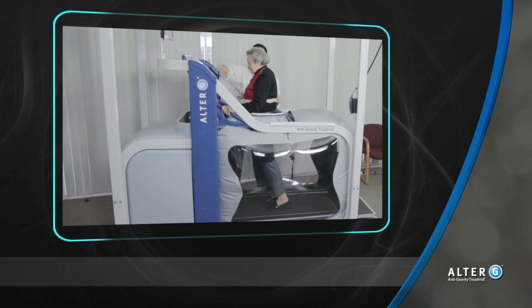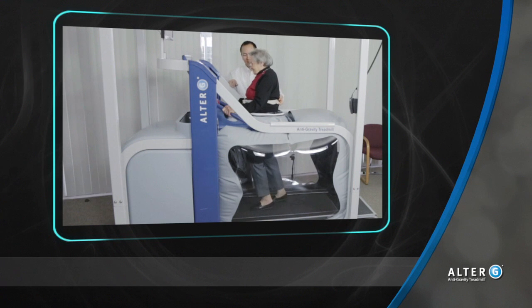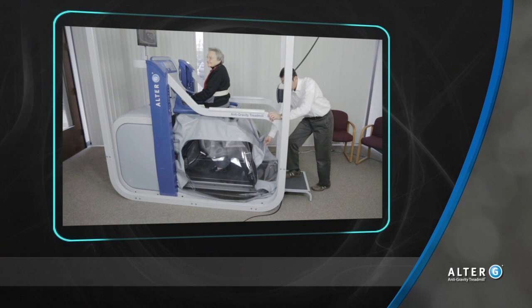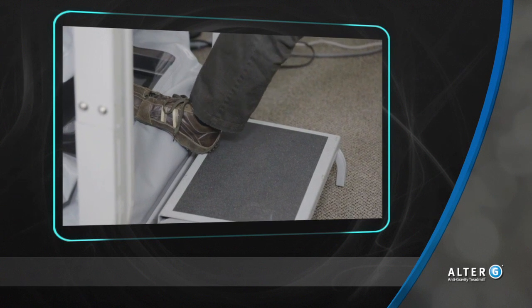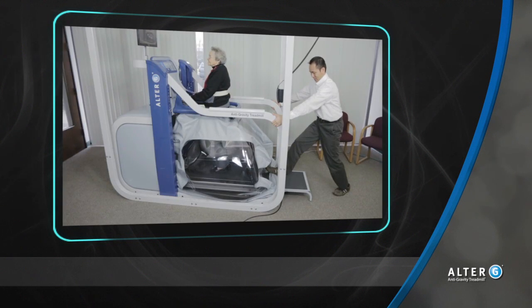If the belt is sliding after calibration, simply start the treadmill at the slowest speed and reposition the user's feet underneath their center of mass. If the belt continues to slide and the patient is unable to reposition their feet, a brake can be applied to the treadmill belt by stepping through the bag on the end of the treadmill. This will stop the treadmill creep and allow the patient to reposition their feet.